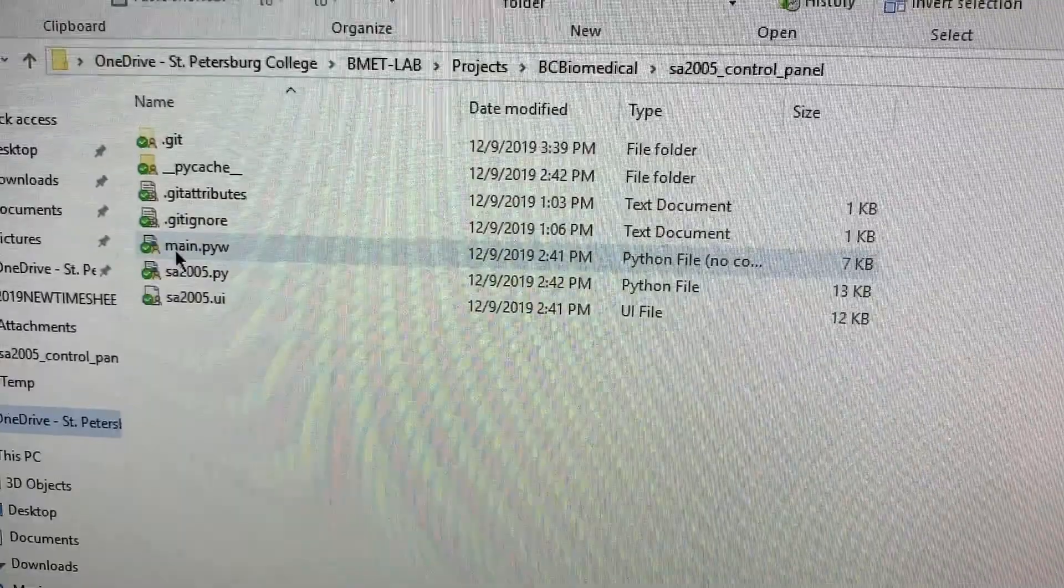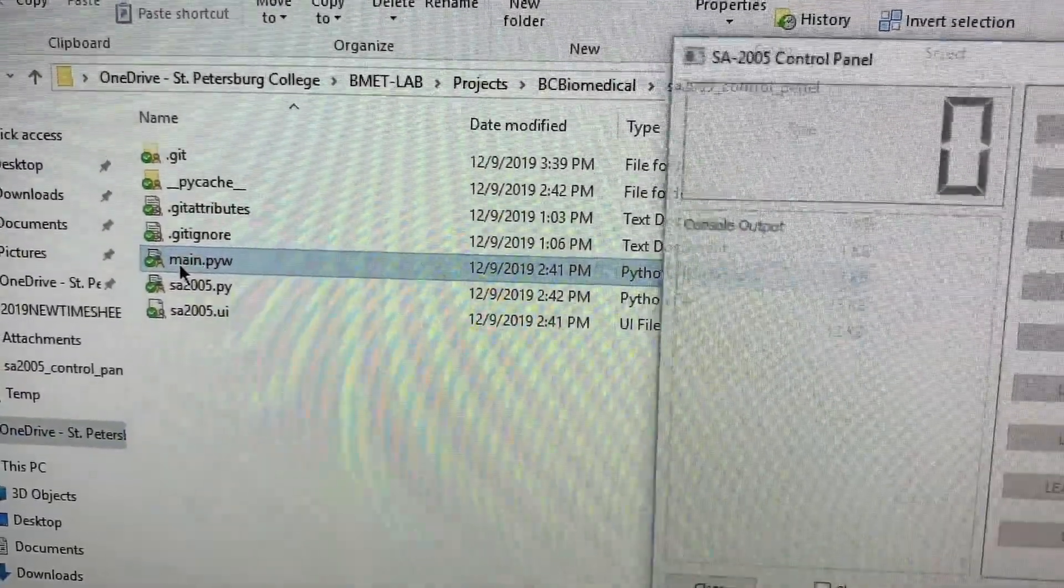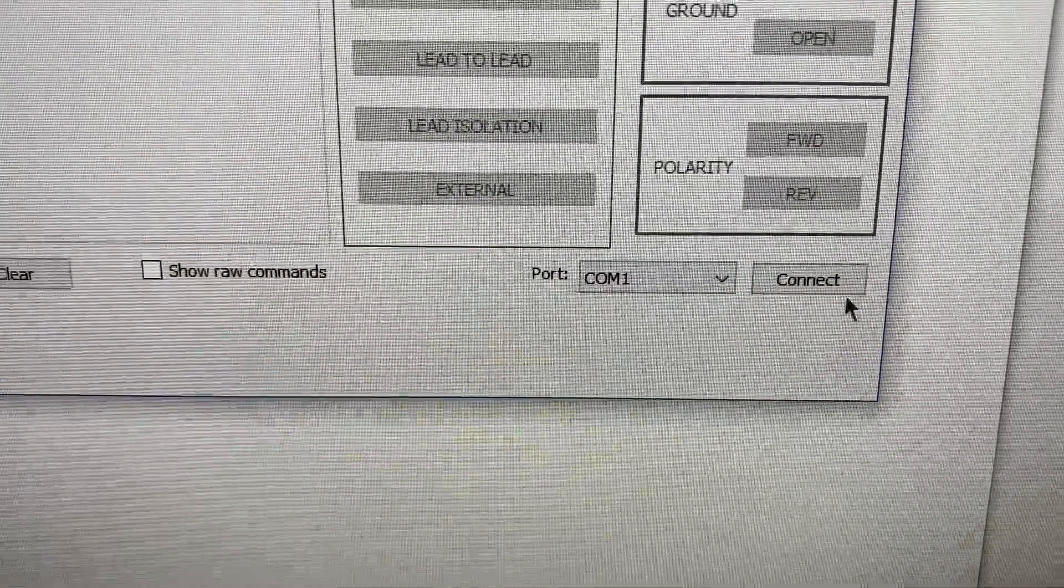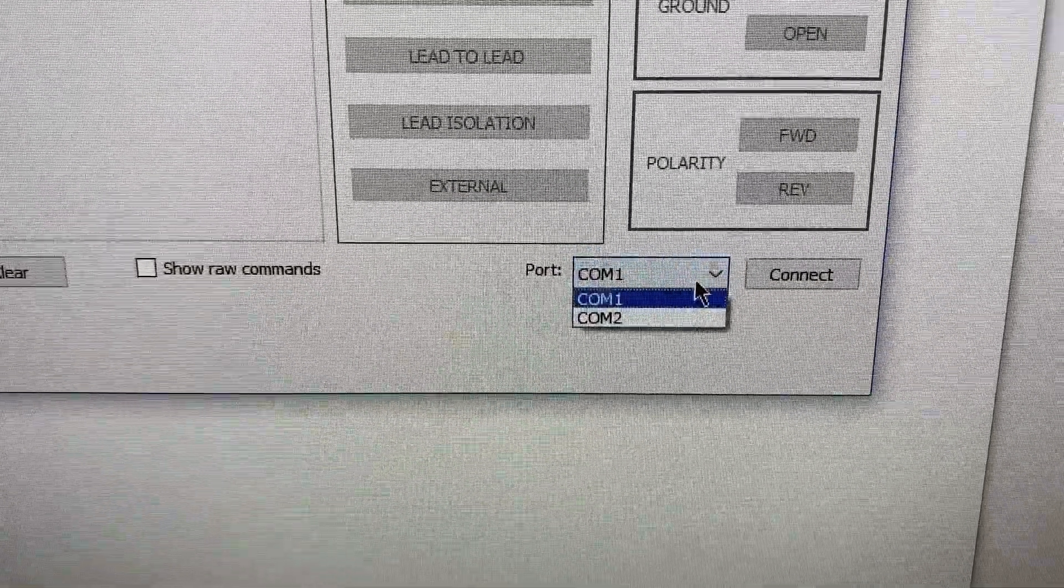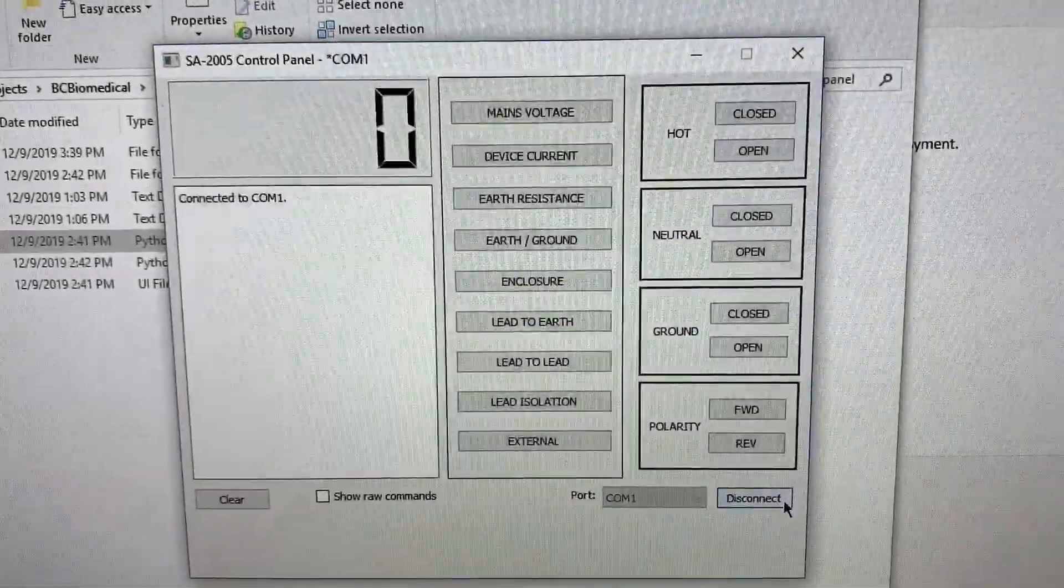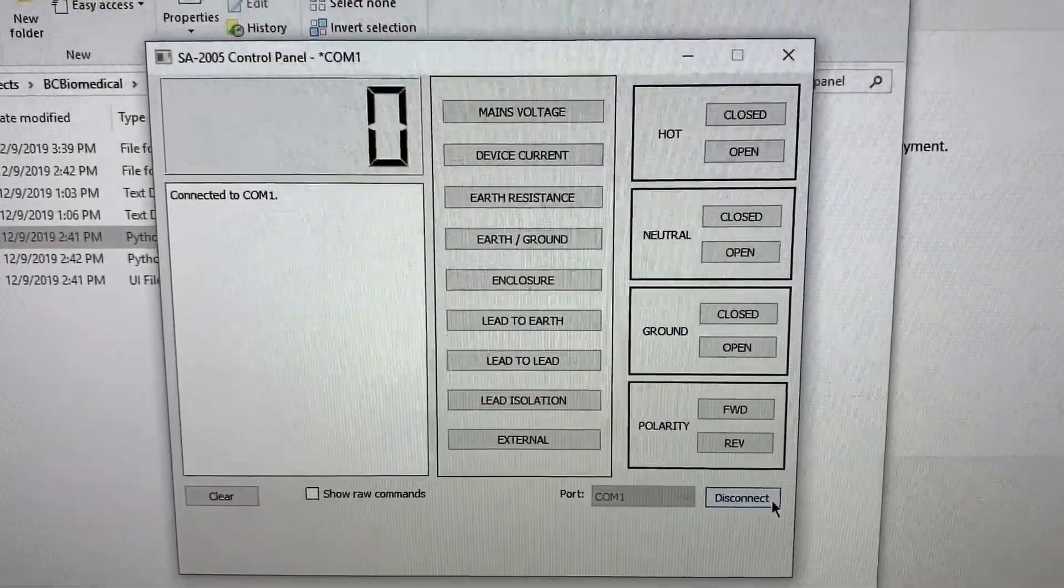So in here I can open up the program here. It'll open up a user interface where I can select the COM port for the safety analyzer and connect to it.